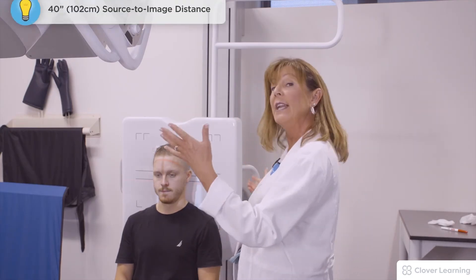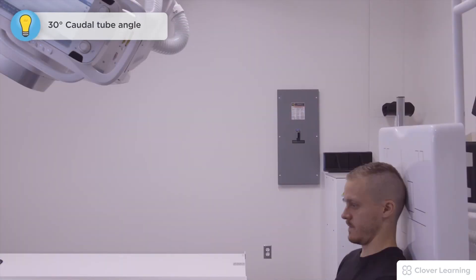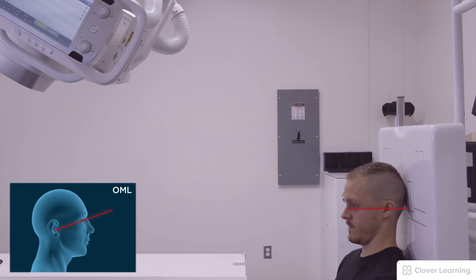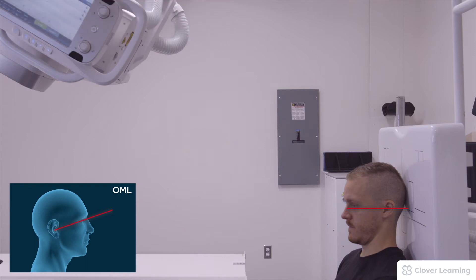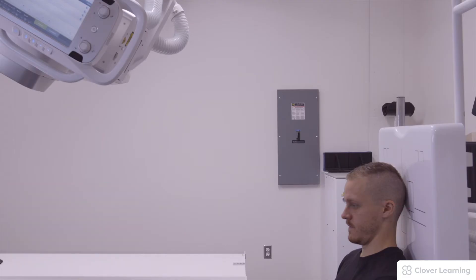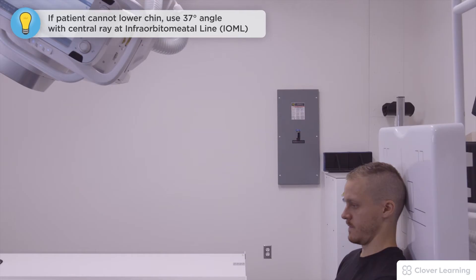For the AP Axial view of the skull I have my patient sitting at a chair because I have a substantial angle. I've set it at 40 SID. I have a 30-degree angle because my patient is able to lower his chin, and I am going to use the OML, which is the orbital meatal line. If the patient is not as flexible, we use a 37-degree caudal angle and we'll use the IOML, which is the infraorbital meatal line.